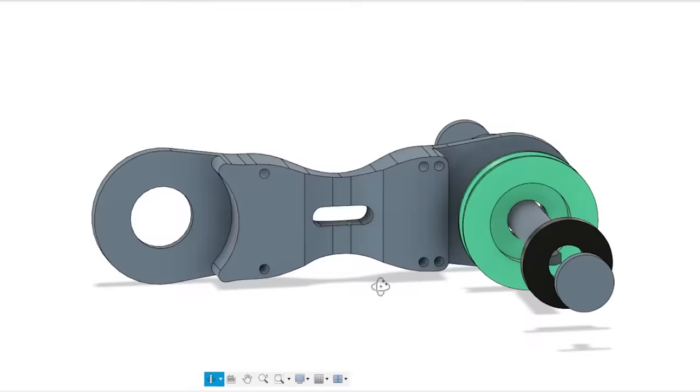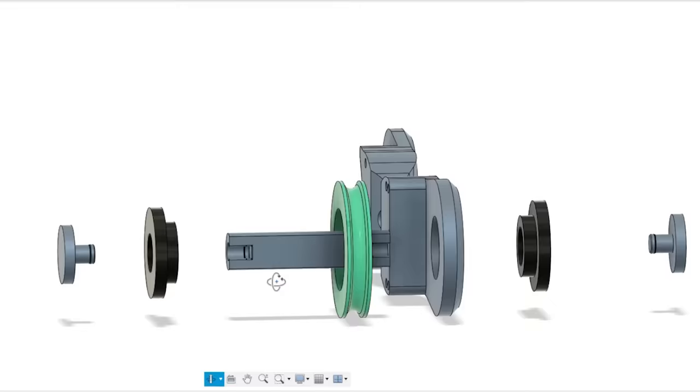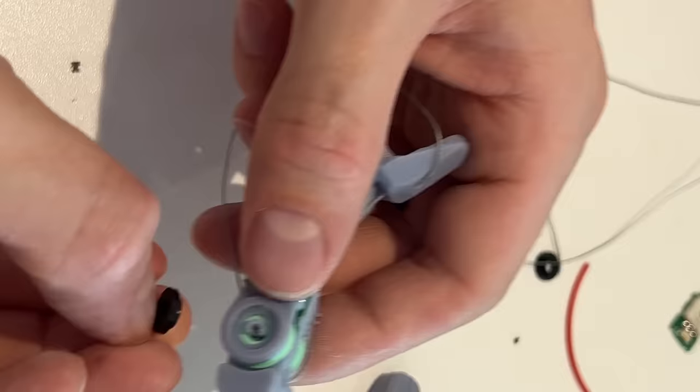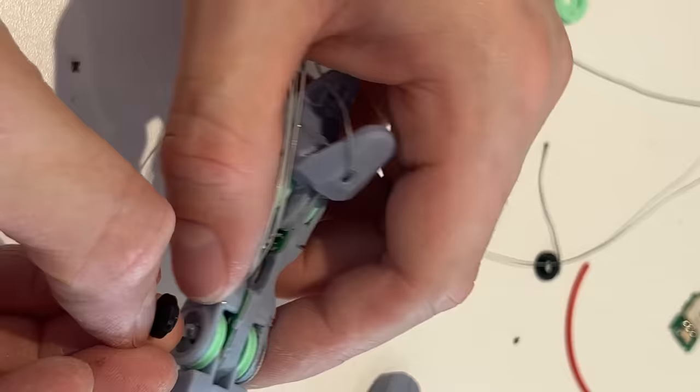I also decided that two bearings per IP joint was too heavy, clunky, and expensive so I switched to nylon shoulder washers. These are pretty low friction for the axle rod and the shoulder also provides a smooth surface for the internal pulleys.